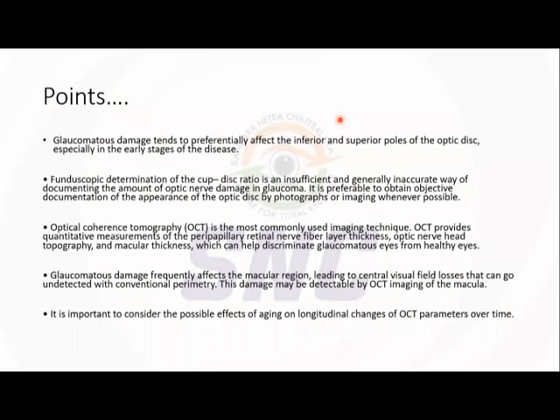And I have mentioned RNFL should follow a double hump. These should be looked for before going for the color coding. Sometimes if it is not properly taken, red may be seen. That is a false positive. So in an OCT report you should look for false positives and false negatives also. If you go directly for the color coding, it might be red or green, we don't know.